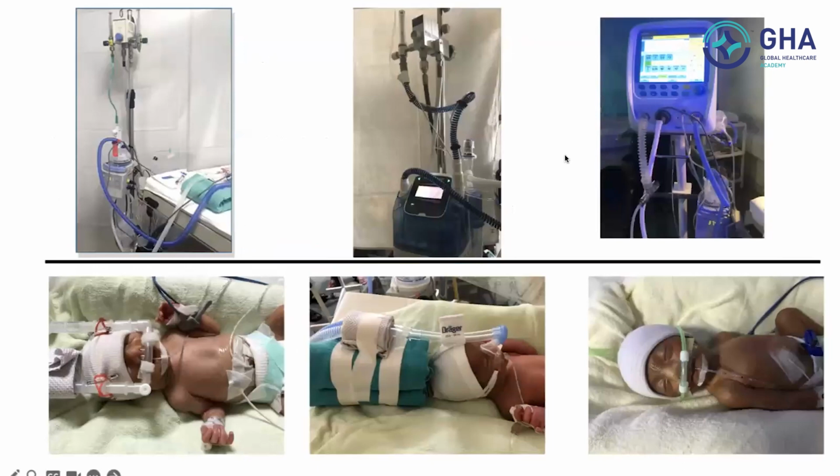So these are the three different machines with which you can give CPAP. This is a typical Fisher & Paykel bubble CPAP. This is another bubble CPAP, and this is a ventilator CPAP. Now the machines are three different: a ventilator, and these two are bubble CPAPs. Now the interfaces: it can be given with Hudson prongs, with a mask, a Drager mask, or with a RAM cannula.